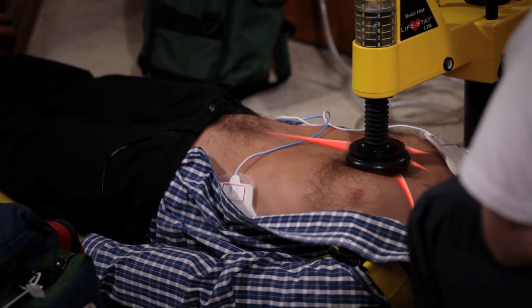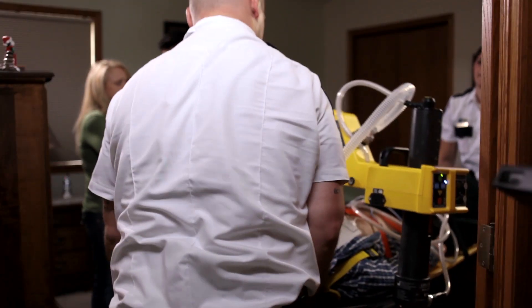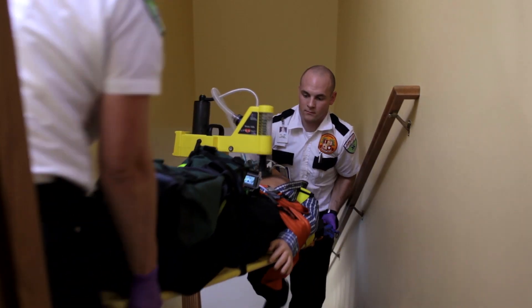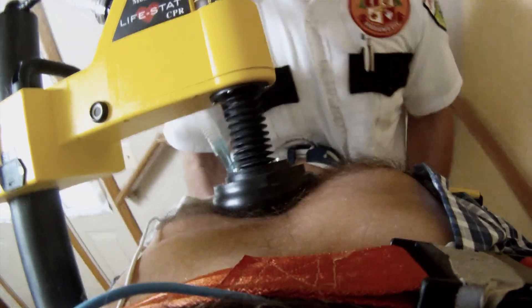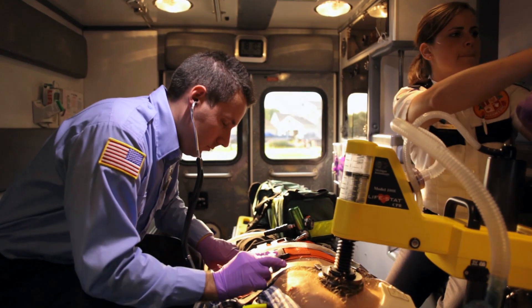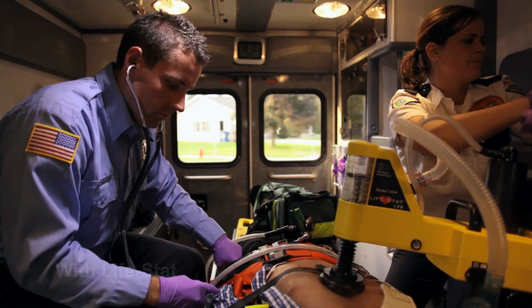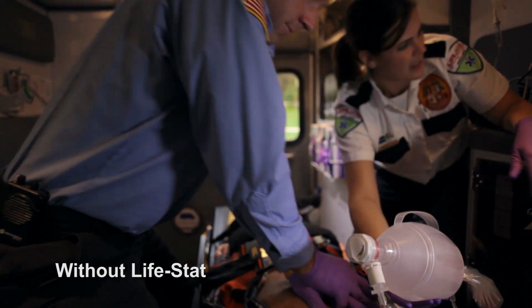Cardiopulmonary resuscitation plays an important role in creating and maintaining adequate perfusion pressure. The Lifestad delivers consistent, perfect compressions and ventilations to the victim, even in situations where traditional CPR is nearly impossible to perform. Lifestad allows paramedics to work more efficiently on the patient and in a manner that is safer while traveling in the back of a speeding ambulance.